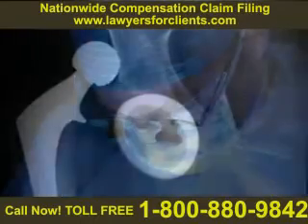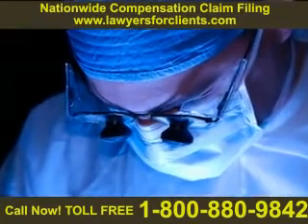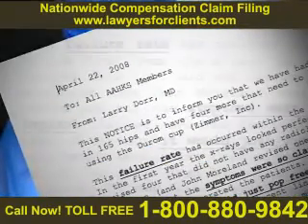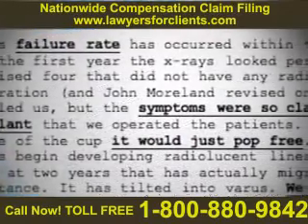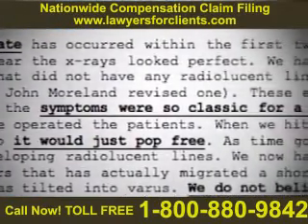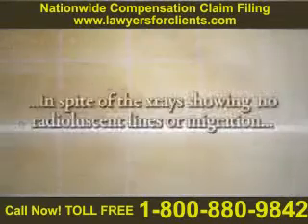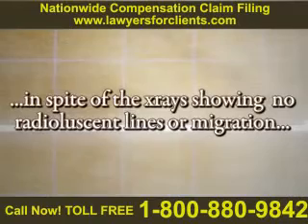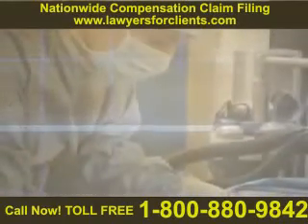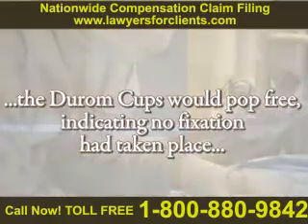revision surgery. The problem with the Durom cup first came to light when world-renowned orthopedic surgeon Dr. Lawrence Dorr wrote a letter to his colleagues at the American Association of Hip and Knee Surgeons, warning that he had performed revision surgery on several of his patients who showed symptoms of a loose implant, in spite of the X-rays showing no radiolucent lines or migration. During the revision surgery, the Durom cups would pop free, indicating no fixation had taken place.